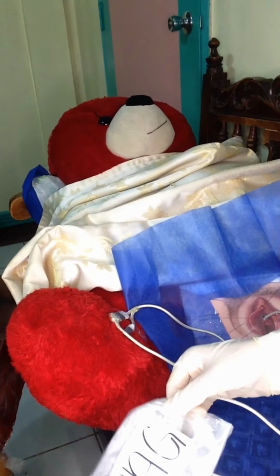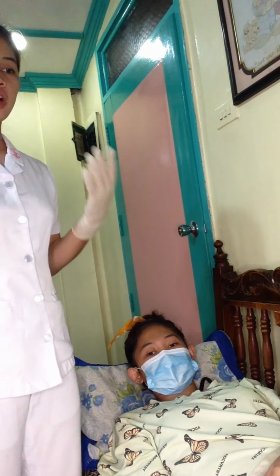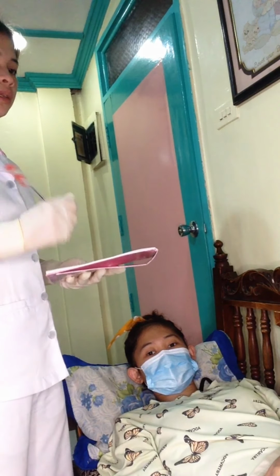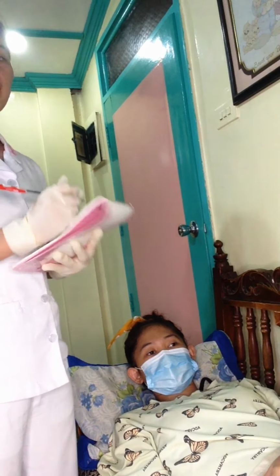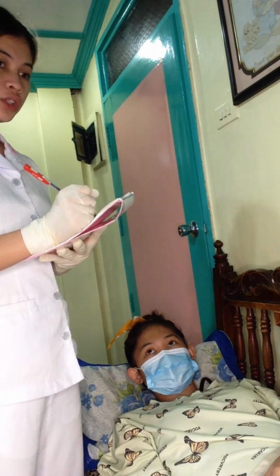So next is place the patient comfortably. Then do the aftercare. And also record the time of procedure done, amount, and color of initial output. So in our documentation, the procedure is done by 9 a.m. Patient tolerated the procedure well, and 10 ml of cloudy amber urine noted, and we will continue the monitoring. That's all. Thank you.